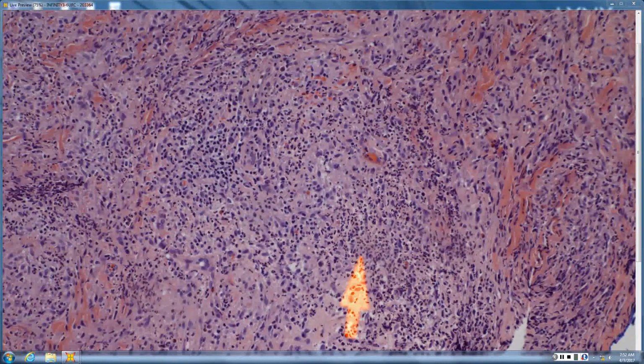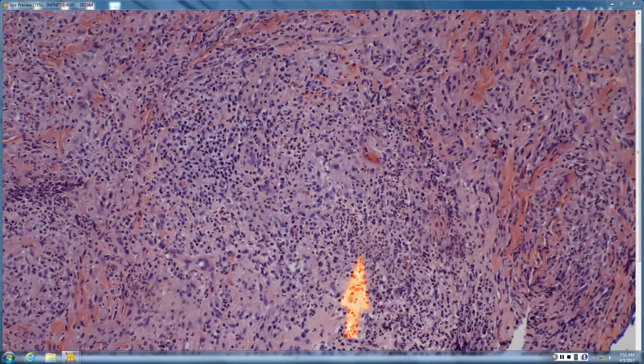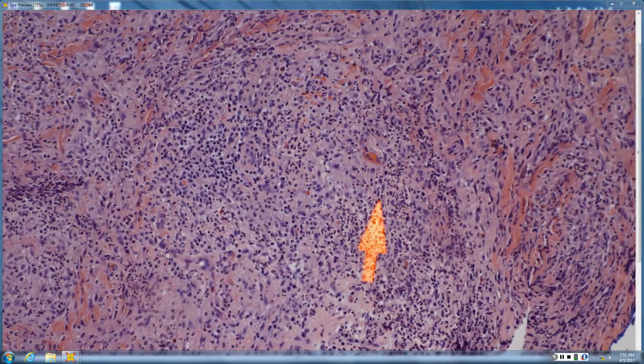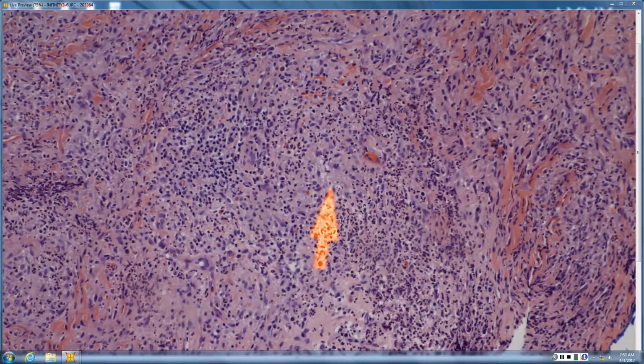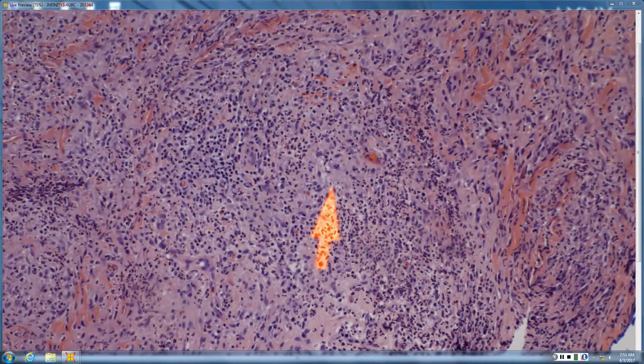They came out of the vessel and then broke up. So any kind of vascular neoplasm that tends to have clusters of neutrophils down in its very heart and center, and amphophilic smudgy collections, like bacillary angiomatosis, correct. So the clusters of neutrophils suggest that this is an infectious vascular neoplasm. The clue is you've got a capillary proliferation. It's not particularly lobular like a PG, but it's definitely a capillary proliferation in the dermis. And all through it you have these little clusters of neutrophils, like it's whispering, saying, I'm infectious, look at me, all these neutrophils, little pockets of pus.